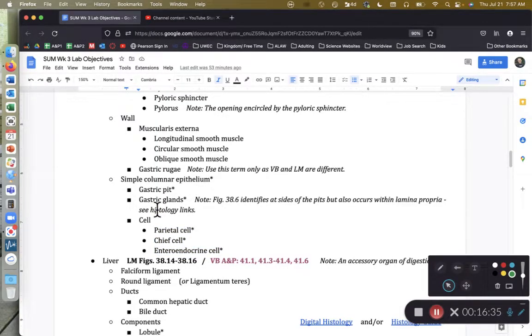So we covered in this video the esophagus and the stomach, both the anatomy and the histology.